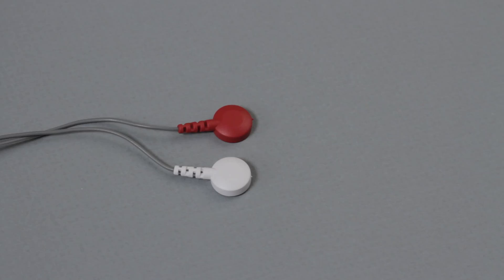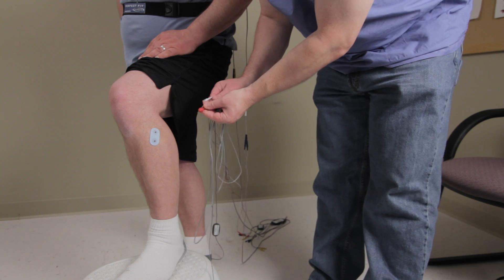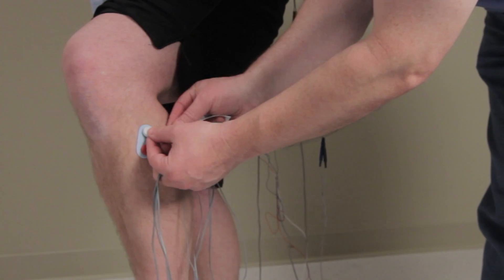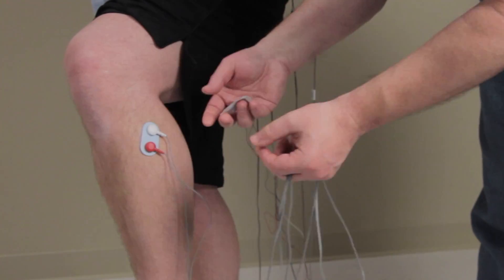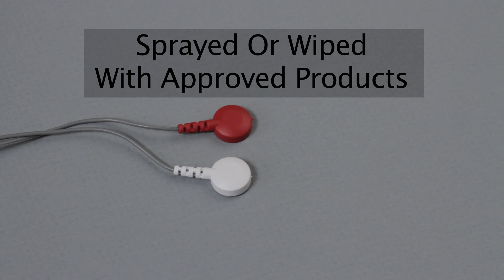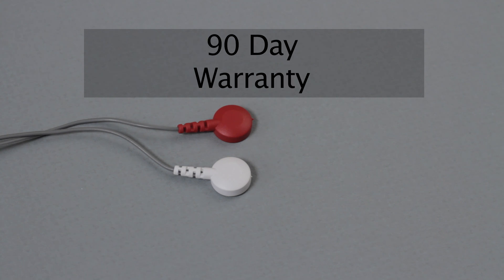The dual snap electrode lead wires were designed as the perfect combination with the dual snap electrode patch. With two snaps on one wire, it allows you to have just one wire per leg instead of two. These are 119 pound strength wires for the best in durability. The wires can be sprayed or wiped with approved cleaning products and have a 90-day warranty.